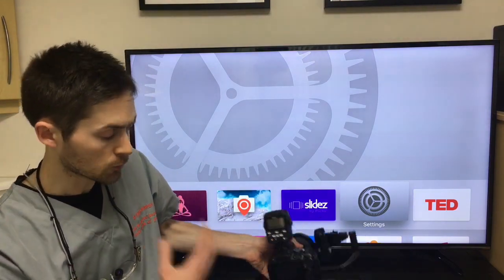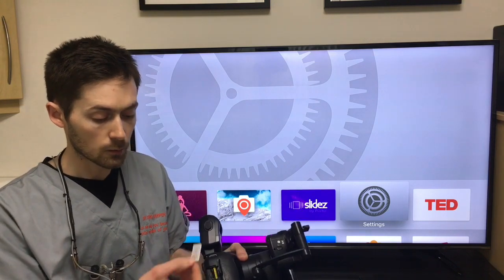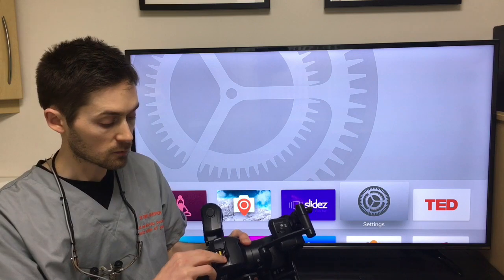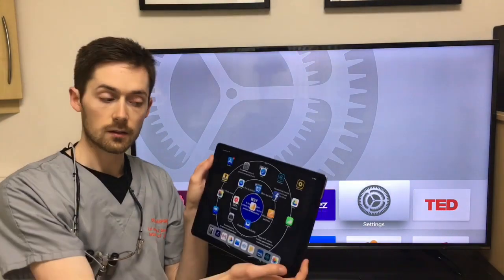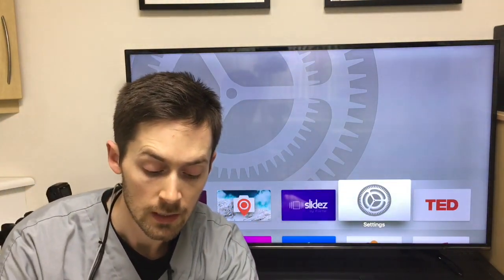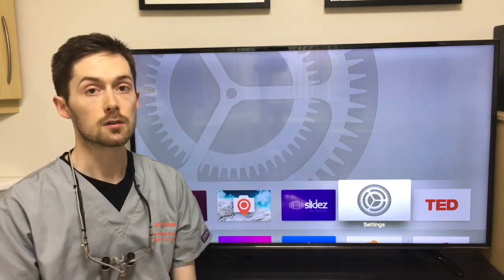This is my camera. I've talked about that in more detail previously, but in it I've got a Wi-Fi Flash Air SD card, which allows me to take photos and quickly put them on the iPad. This is the iPad itself, which is an iPad Pro. Any iPad will work just fine. And I use that for handling and storing all of my photos.